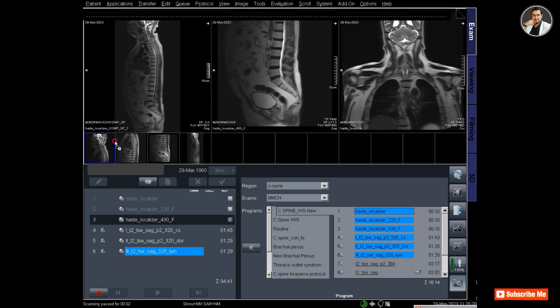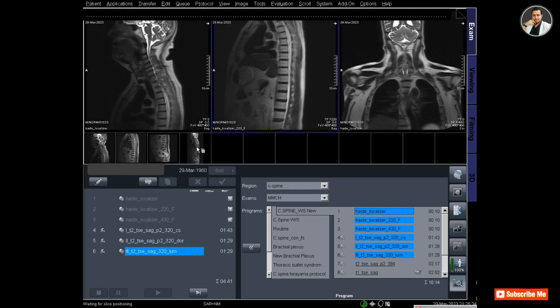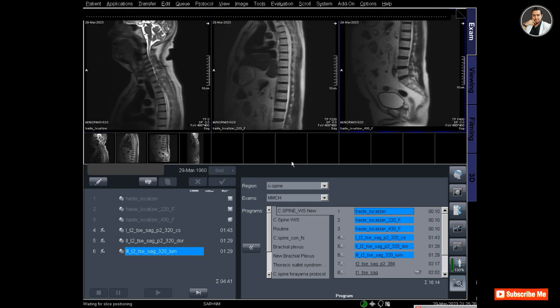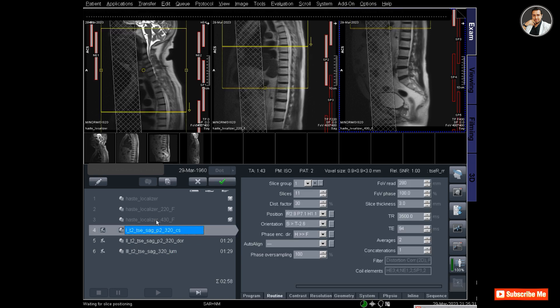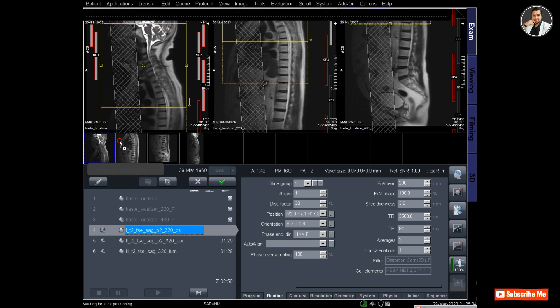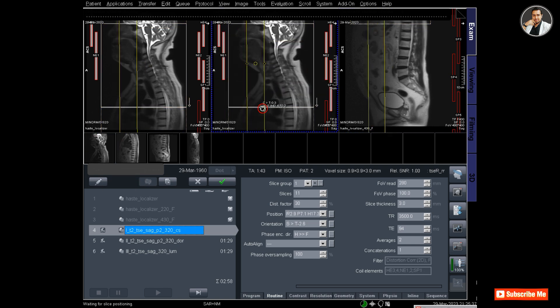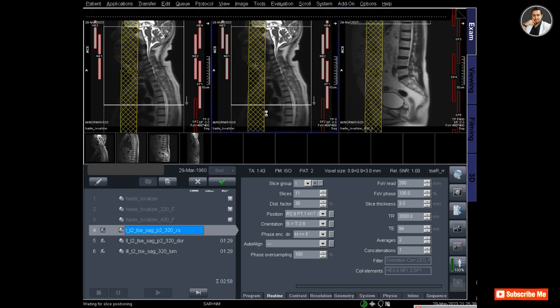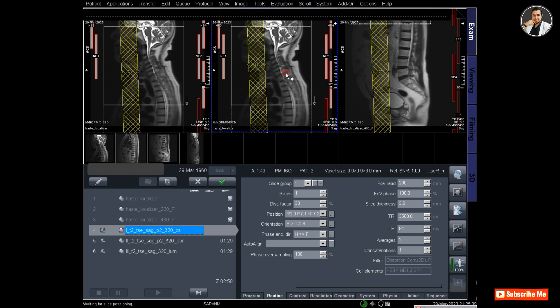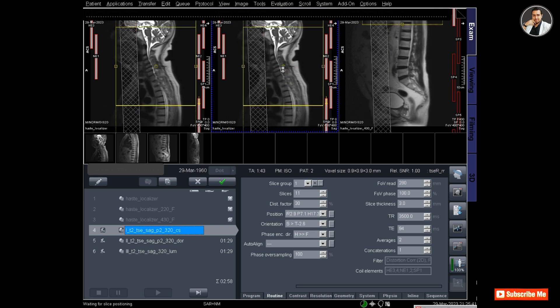In the first segment there is the Whole Spine localizer. There are the three localizers - I drag the first one which is cervical, then dorsal and lumbar. Now I'm planning for the T2 sagittal cervical spine. This is the first part of the Whole Spine, and for this I'm planning on the sagittal image.